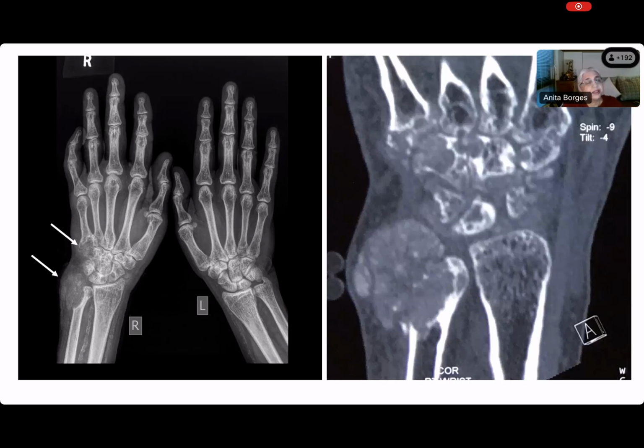And this was done beautifully in more than one of the previous lectures. Mansi, what should we notice about any bone X-ray? The laterality first, and then the view, whether it is AP, then whether all the bones are in anatomical position, then the location of the lesion, then the nature of the lesion, whether it is epiphyseal, metaphyseal. What do you need to say about location?